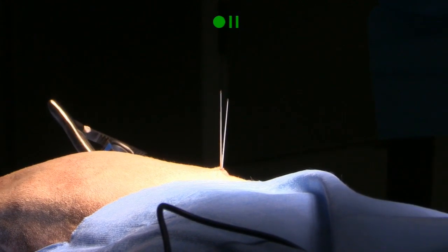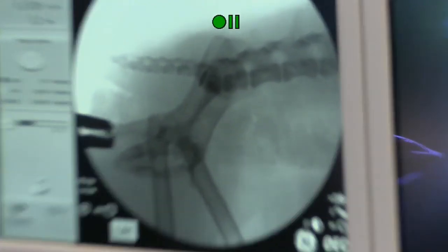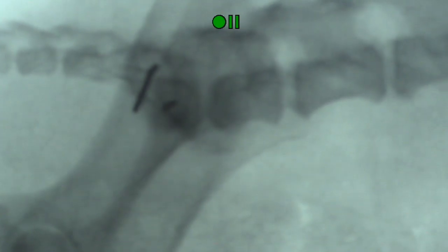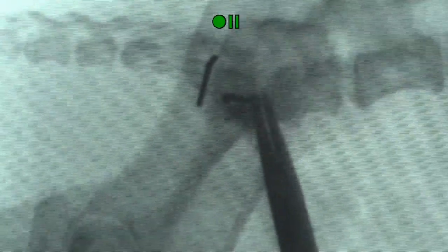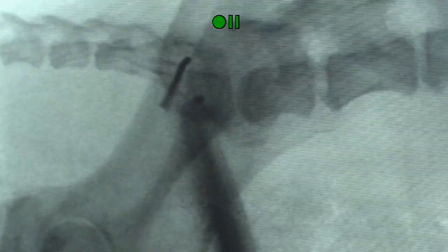Good. Yeah, it feels like a nice solid bone all the way through there. So, check on the lateral view. You can see the pin. It's actually hard to make out the profile of it. So that pin is absolutely perfect, right in the middle of the body of S1. That looks really good.